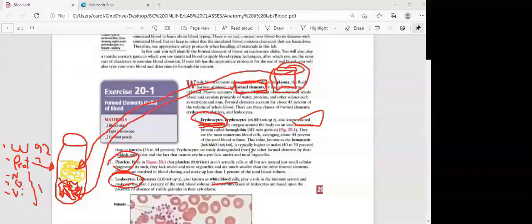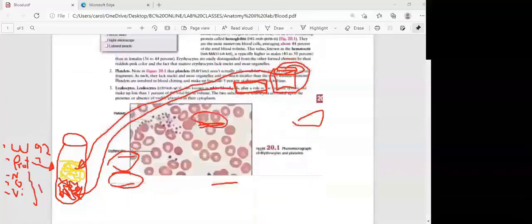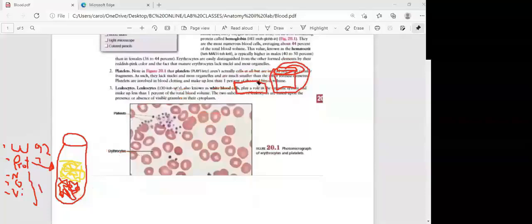So then let's keep moving. Right here, if we get this blood and we put it in the microscope, well, this is what we actually see. As I said, most of the cells that you have in your blood are going to be red blood cells. That's why most of them are going to be red, right? Which is this one. These ones are the red blood cells right there. You have some platelets in here right there. Okay, so you have mainly red blood cells, platelets, right? And just a few white blood cells here and there. Okay, but this is what you see. So this is going to be called a blood smear.